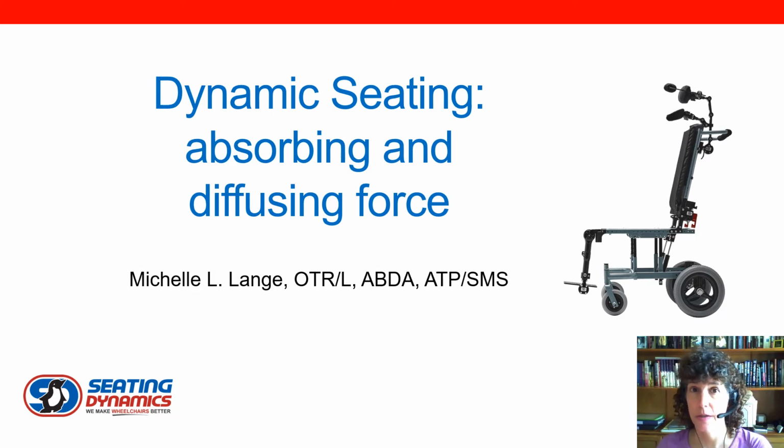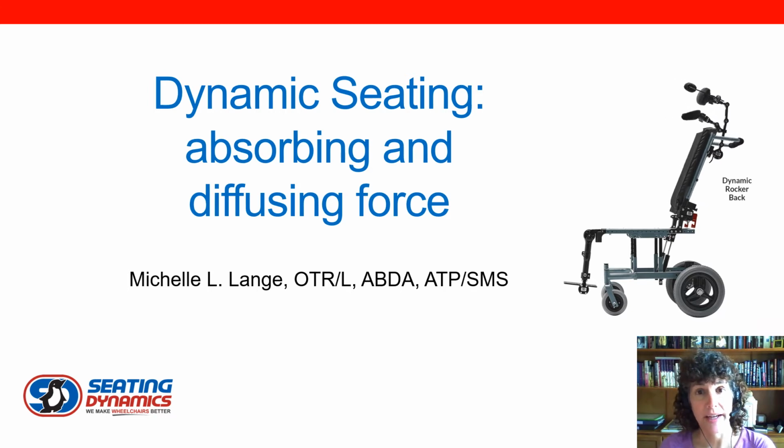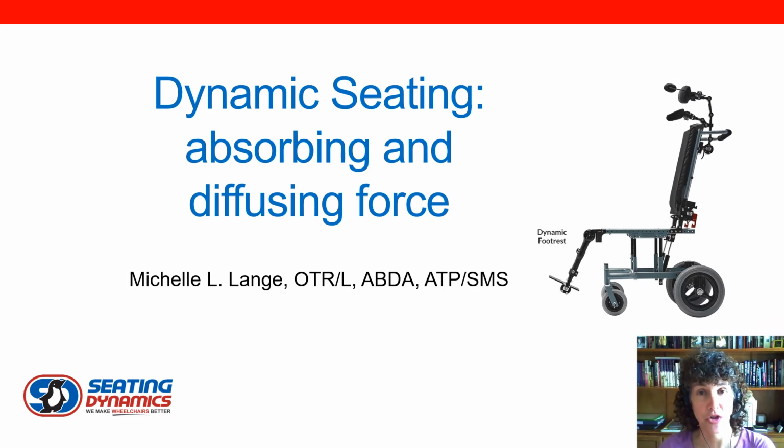Today we're going to talk about dynamic seating, particularly looking at how dynamic seating is used to absorb and to diffuse force for clients who have significant forces, usually due to increased muscle tone.